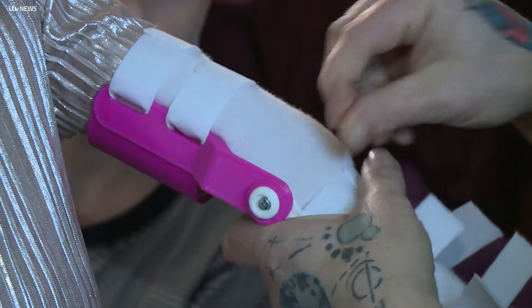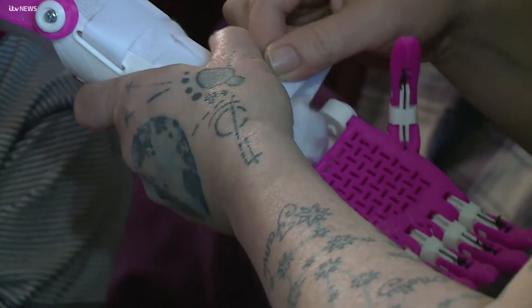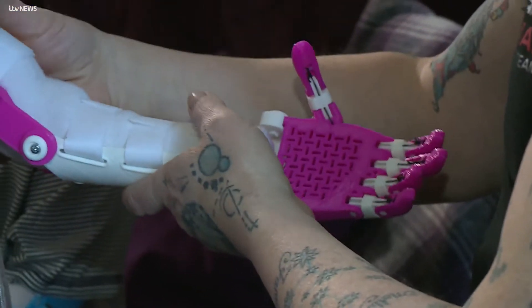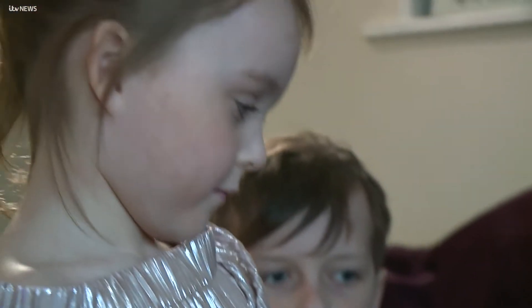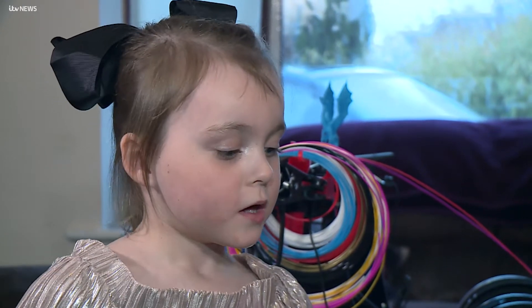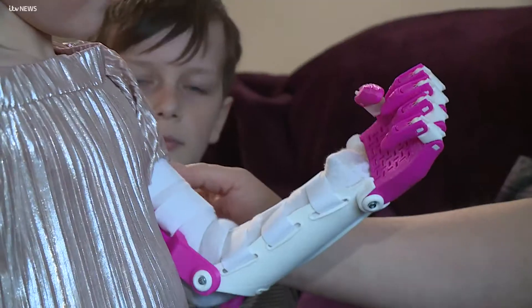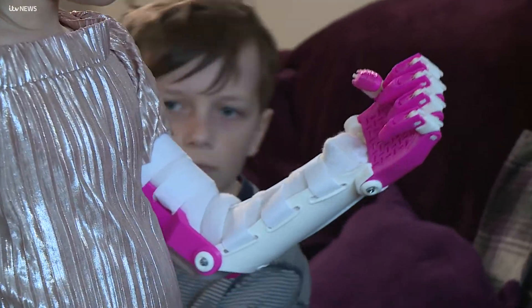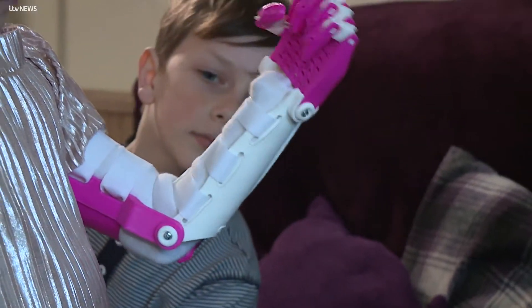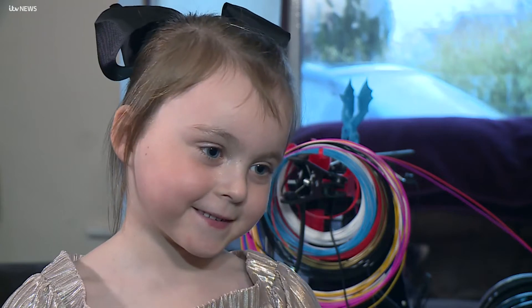A gift like no other. This is the moment Keira Campbell was able to use her hand for the very first time. Is that okay without being too tight? I'm really happy because he made it for me so I can hold things. When I bend it, it always bends in. And you couldn't do that before, could you?